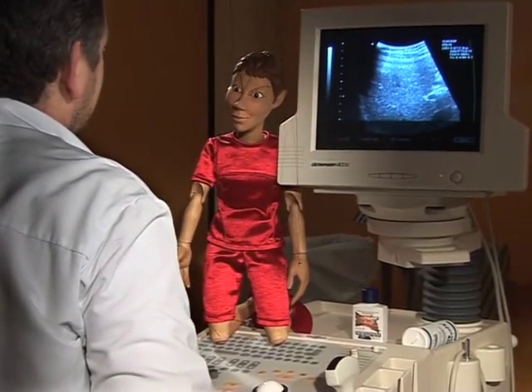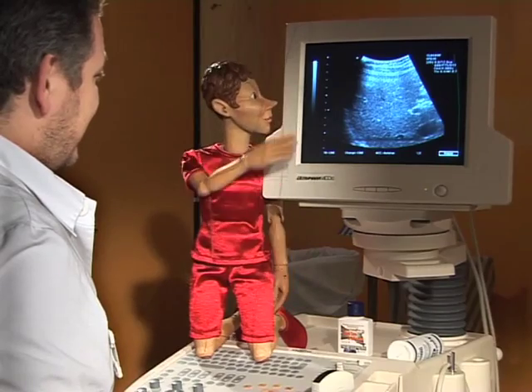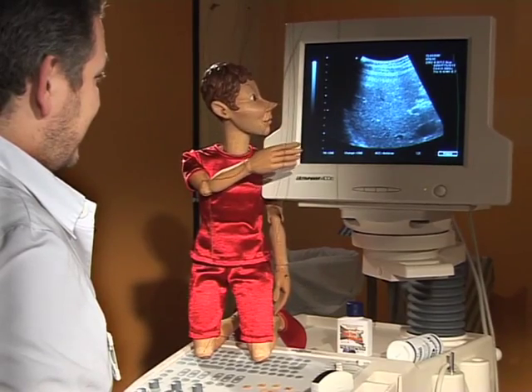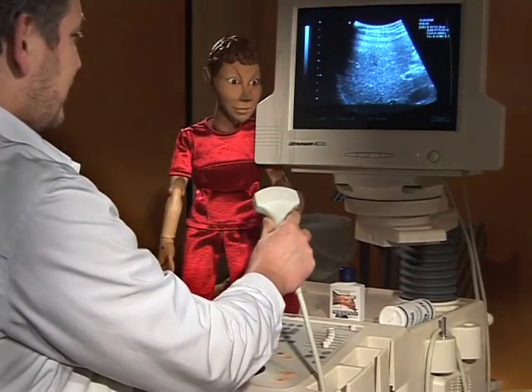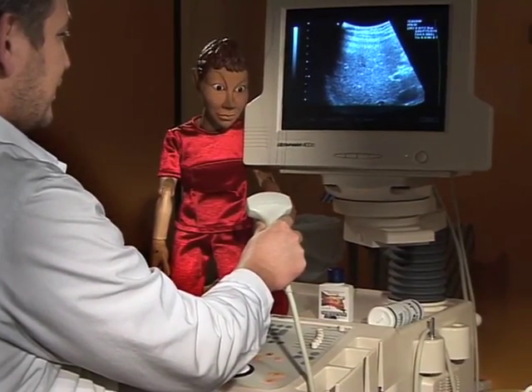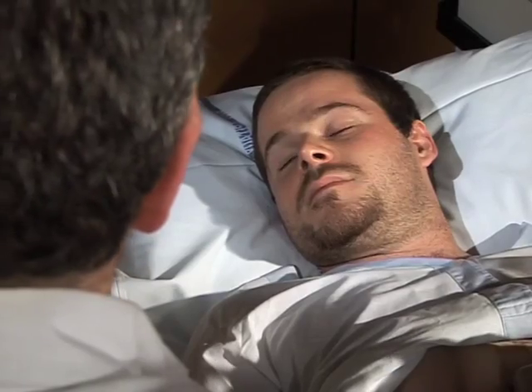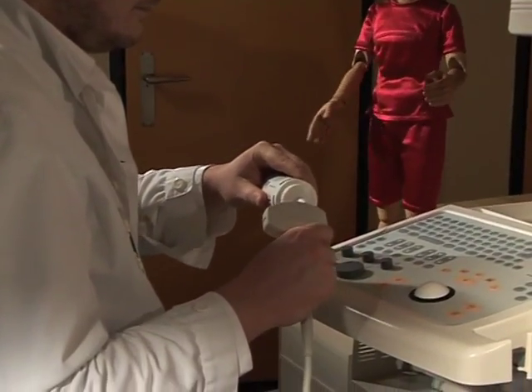May I show them the scanner? Yes, of course, Paprika. Look, this is where we find the control buttons and the screen to observe the images. And this is the probe which we place on your body. We use gel to enable the ultrasound waves to pass between the probe and your skin. It isn't unpleasant. You'll see.